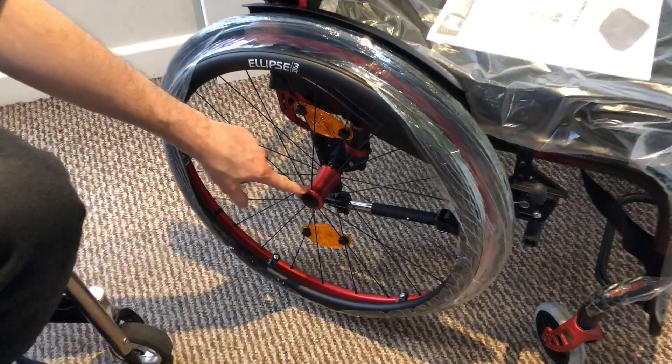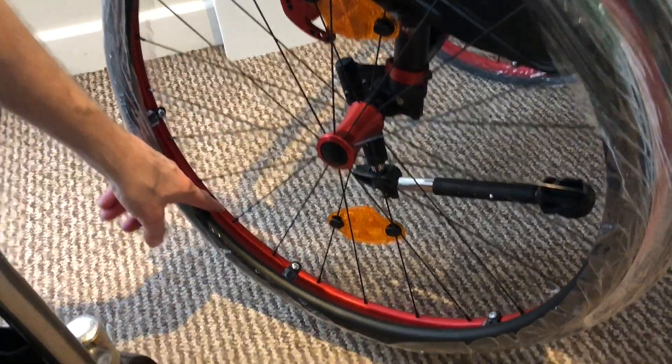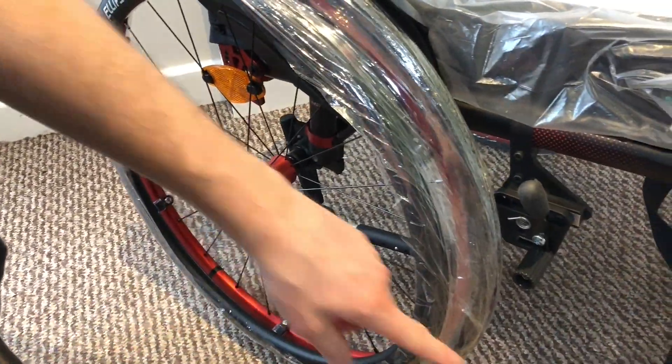We've got the colour set. As you can see we've got the hub, the rim, the back brackets, and the caster wheels.